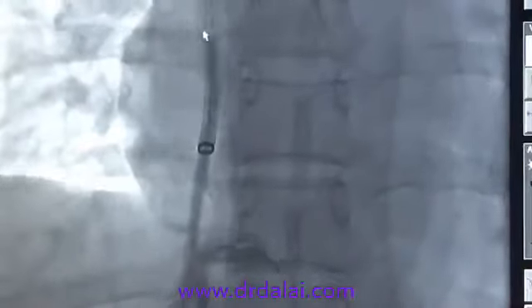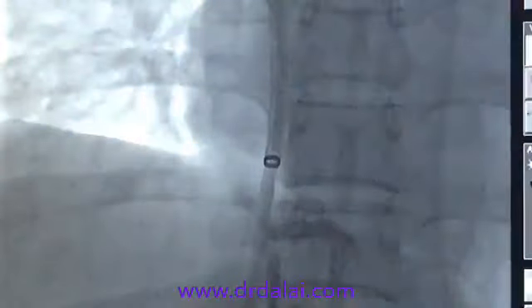My femoral sheath has gone inside the jugular sheath, and then I will push a 035 wire. That's my 035 wire going all the way. And once that is done, of course I have taken the balloons and inflated them and made the segment stable. Once the balloon angioplasty was done, it looks quite good. We can see the blood flowing into the heart.